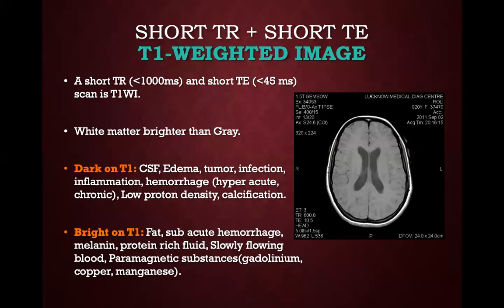What is a T1 weighted image? What will be dark? Usually CSF will be dark, remember. The simple way to remember this, you can take a screenshot of this. You all know this. This is another exam question.